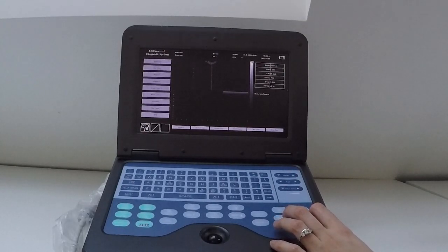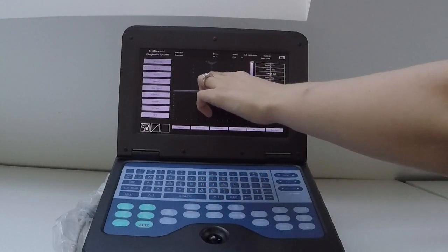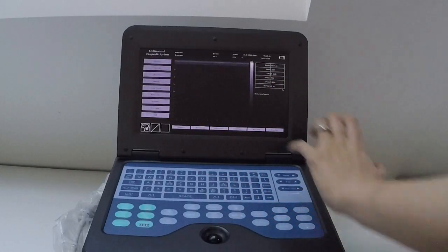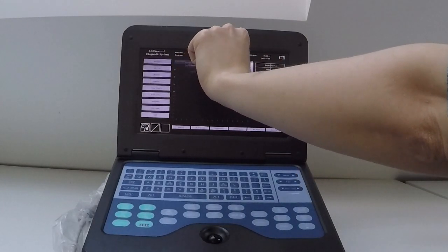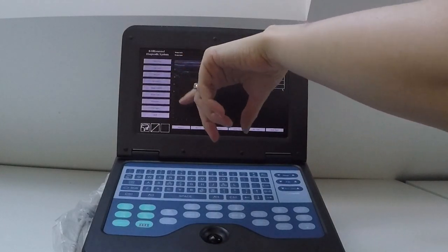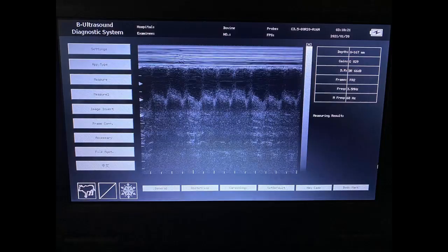M-mode is usually used for cardiac work. If you want to use it, line it up with a beating heart — with the fetus's heart — and press it; press it again to fill up the whole screen. The idea is that you would see the movement of the ventricles, the contraction of the ventricular walls, and the mitral valve moving up and down. From that you could calculate the heart rate if you wanted to, or look for any signs of fetal distress.